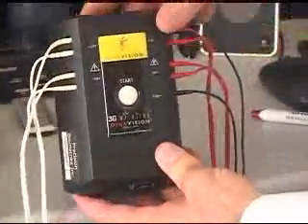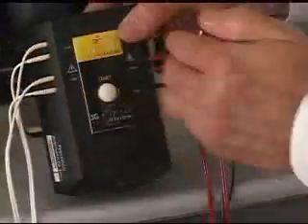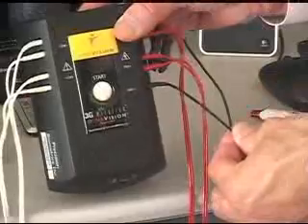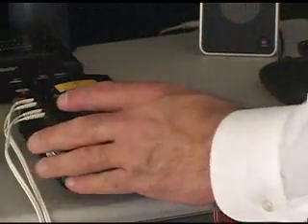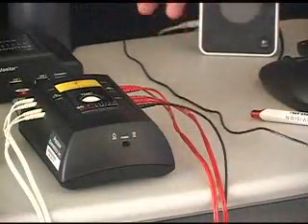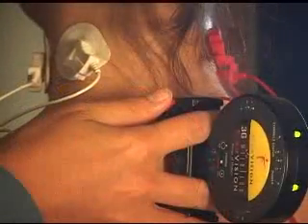Here I'm connecting all the lead wires to the DynaROM device, the dynamic EMG device. The left side is white, the right side is red, with the ground at the bottom. Channel 1 and 2, the top two sets of lead wires, go to the cervical paraspinals. The bottom two go to the SCMs. So you're putting the top two electrodes to the cervical paraspinals, the bottom two to the SCMs, with the ground to the green ground wire.